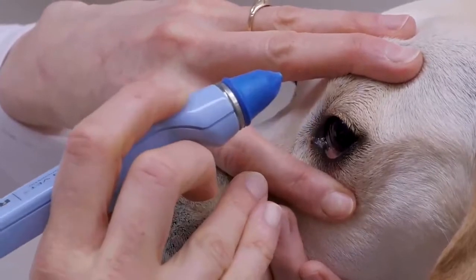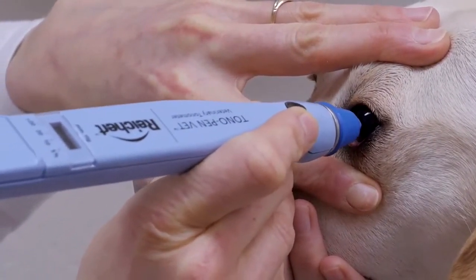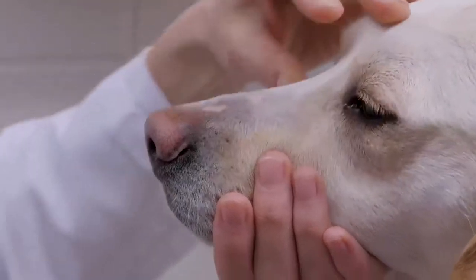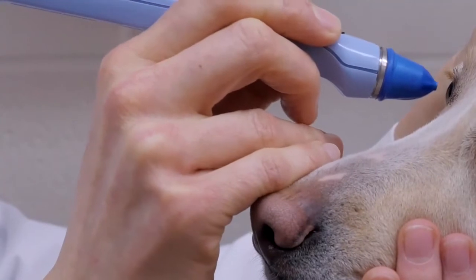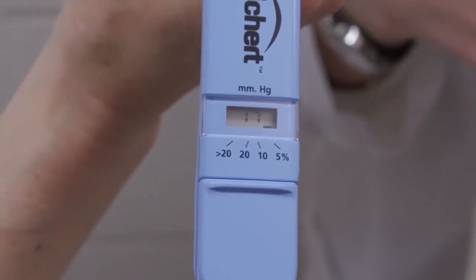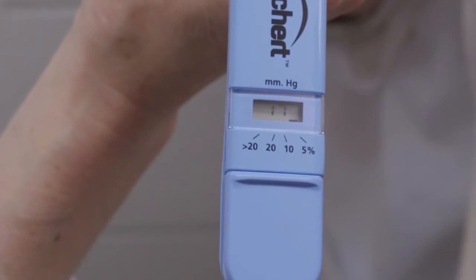The applanation tonometer is held perpendicular to the cornea, while the instrument tip gently contacts the cornea several times in succession. As each reading is taken, a quiet beeping sound is heard. And finally, a louder beep is heard when several readings have been taken and averaged. The final averaged intraocular pressure is then read directly from the instrument. Conversion tables are not required. Applanation tonometry should be repeated until the reliability of the reading is within 5%.